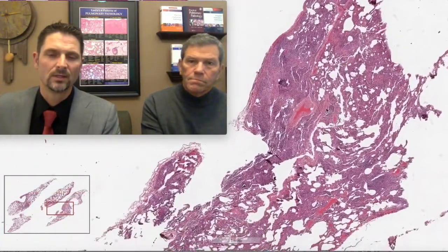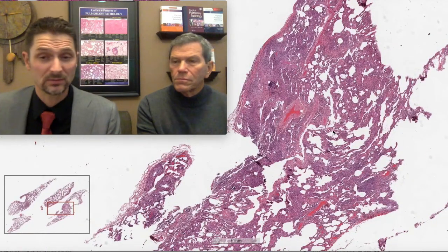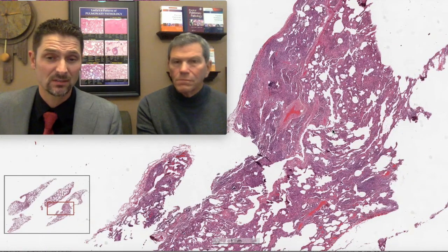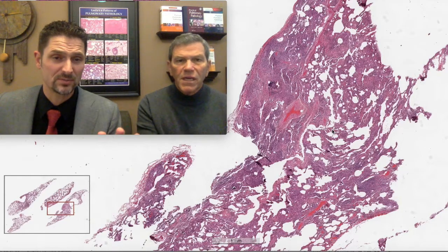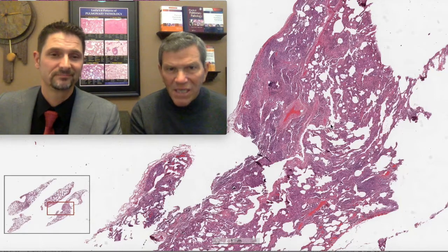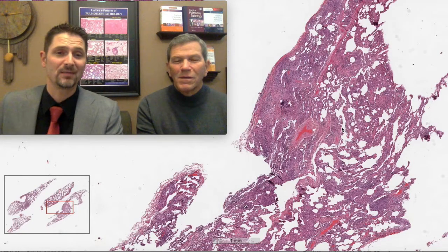Exactly. So remember, for practical purposes, LIP does not exist. Pathologic LIP and radiologic LIP are two very separate things. And if you're thinking you'd like to diagnose LIP, get a CD20 stain, make sure it's not lymphoma, and then call it a robust cellular NSIP.